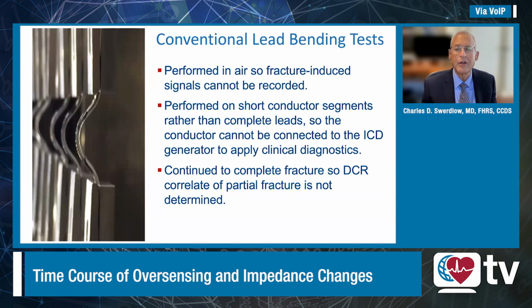Preclinically, conductors are generally tested in air, so the fracture-induced oversensing signals can't be recorded. They're tested on little segments of conductor rather than complete leads, so you can't attach them to a defibrillator to see what the diagnostics are. And then finally, they're tested until the conductor is completely broken, so that the impedance correlates of a partial fracture can't be determined.